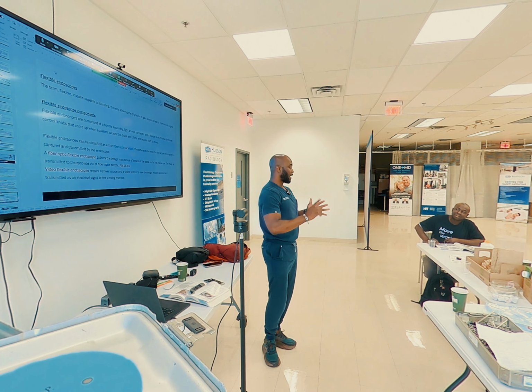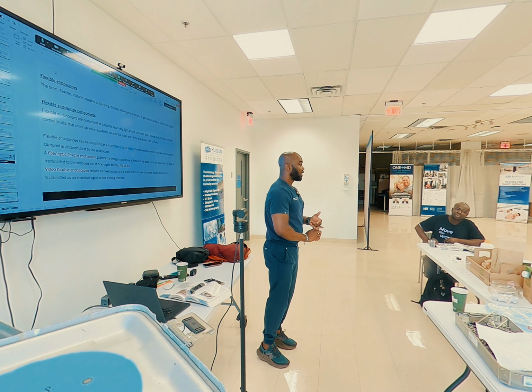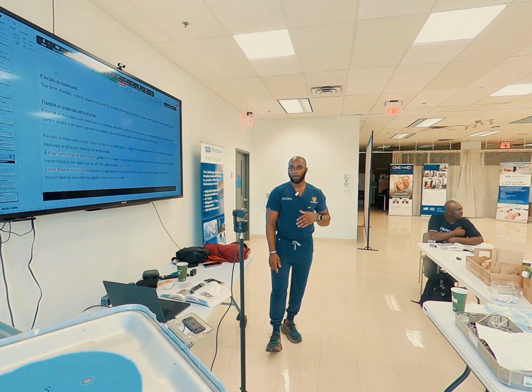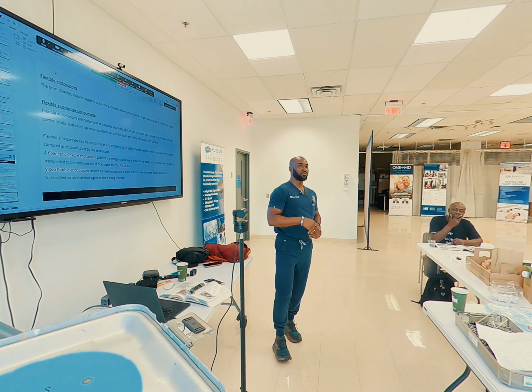You are no longer allowed to perform manual high-level disinfection in medical facilities. True or false? It's false. Why is it true? Because some instruments can only be cleaned manually. When instruments are cleaned manually, we move to the next step.